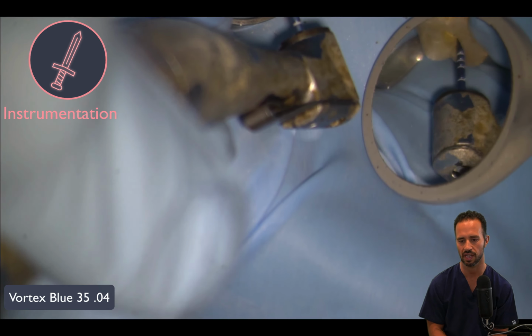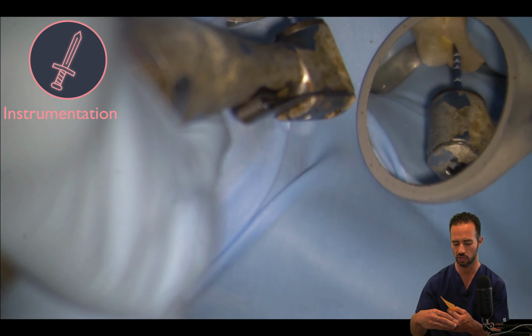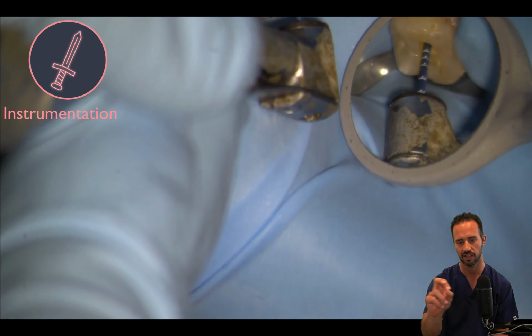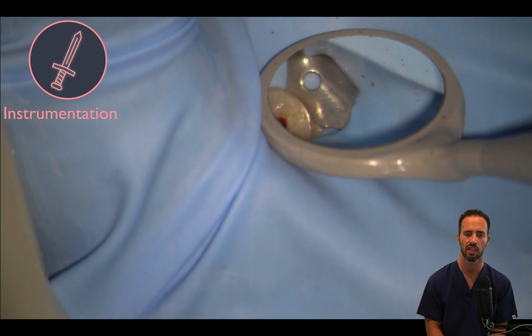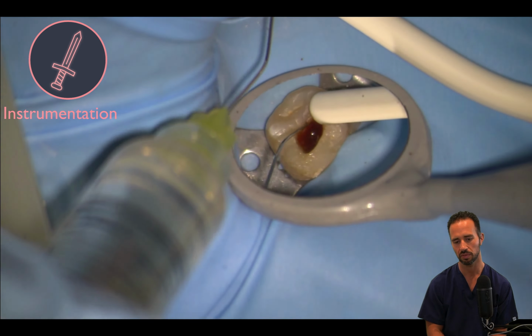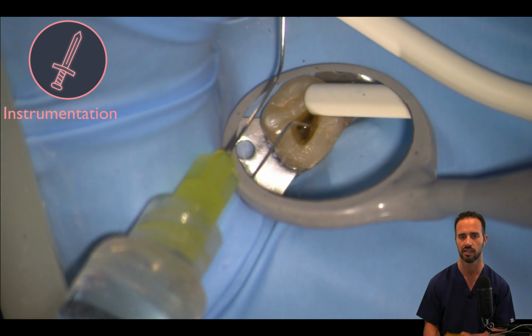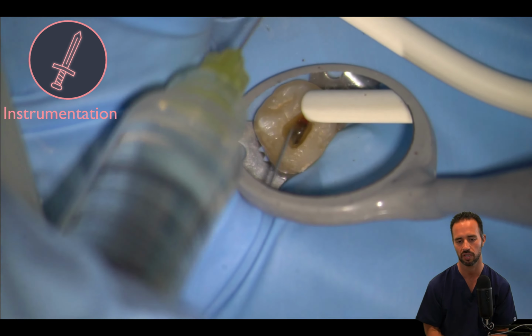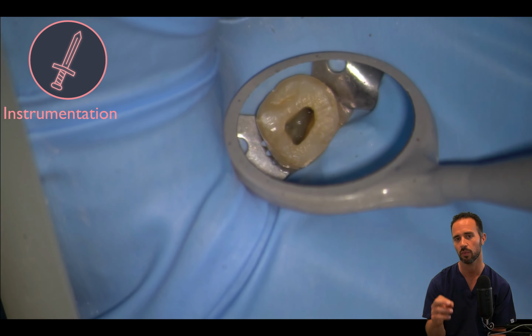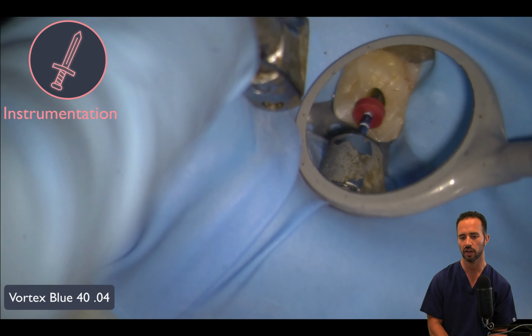You'll notice here that there's no more stopper. The dental assistant will occasionally remove the stopper when he or she goes to wipe the file with the 2x2. Don't beat them up over it. You still have the lines present on the file that you can use to keep track of how deep you're preparing. And there's still a little bleeding in the palatal canal, even though we're this far into the instrumentation. That can happen because, remember, these large canals have a lot of pulp tissue inside. And the 35 is going to be our final rotary file that we're going to take in the buccal canals, both the mesial buccal and the distal buccal, but we're going to go up in the palatal.